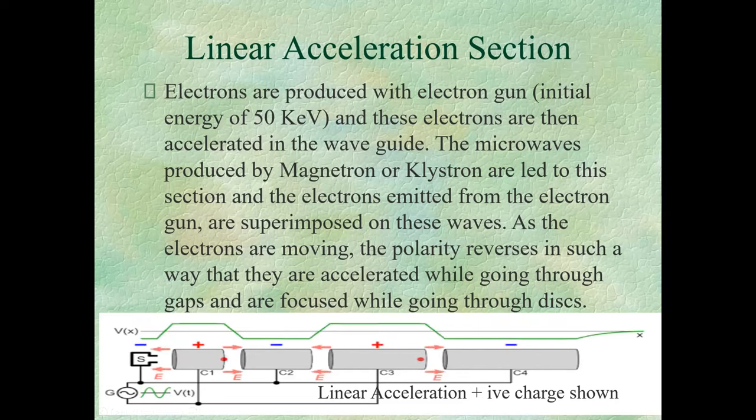What is the relationship between flattening filter and dose per pulse? How does the dose rate increase when flattening filters are removed? So we can have higher dose rates for our regular beams also. The dose rate does not only depend on FFF beams, but for FFF beams we usually treat with 1,000 or 1,400. The reason for that is we have a lot of monitor units, which can be in the thousands, so we want to go through them quickly. These days, for regular beams with a flattening filter, we have dose rates of 600. We vary and usually provide up to 600 at the top, but that's regulation. That's not the result of any flattening filter or FFF beam; those are regulations. They don't allow the use of any higher dose rates.